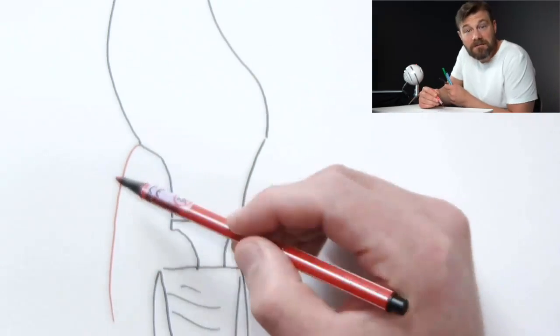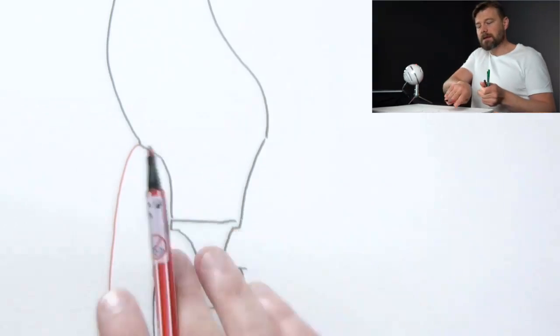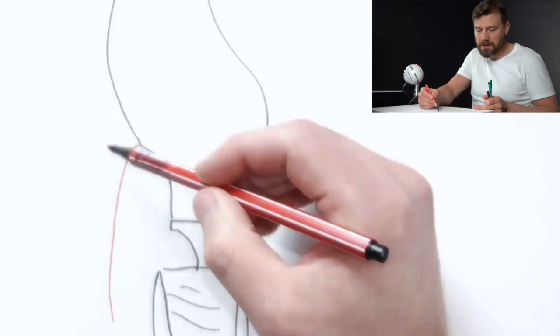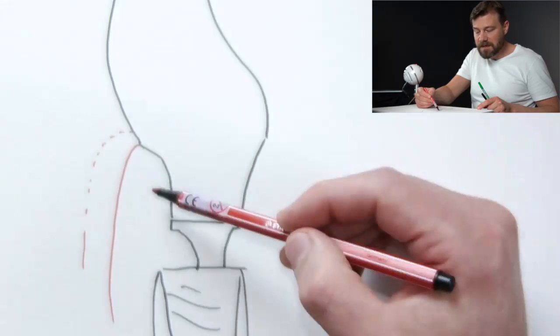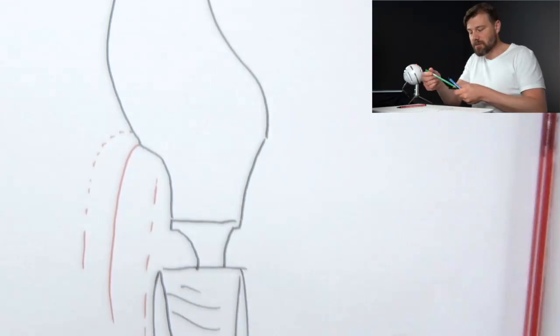As I have a deficiency of soft tissue volume, the buccal surface is under the surface of the crown, okay? Is not on this area here. What happens if you try to prepare this area here to receive a connective tissue graft?